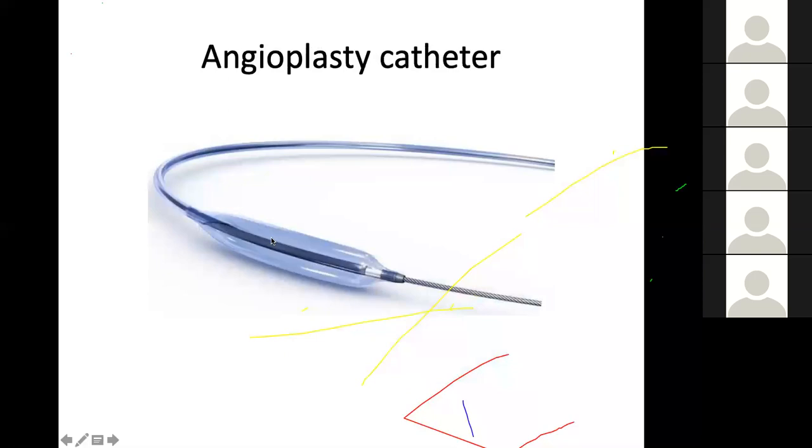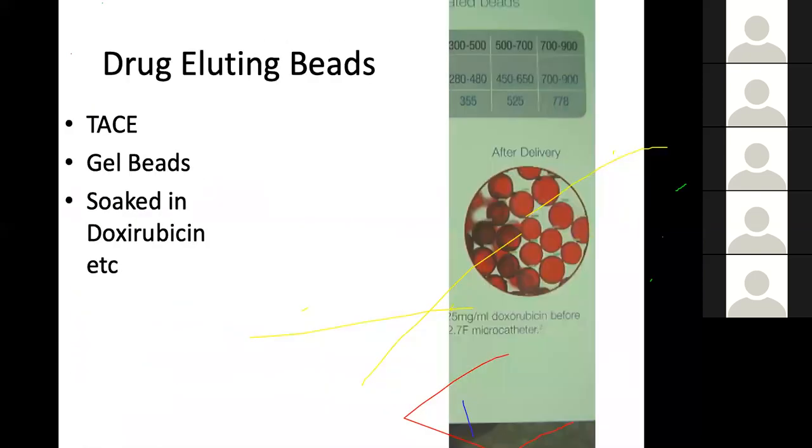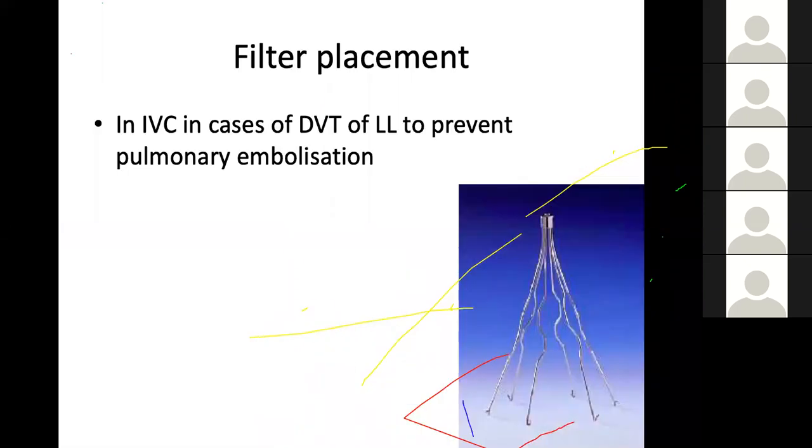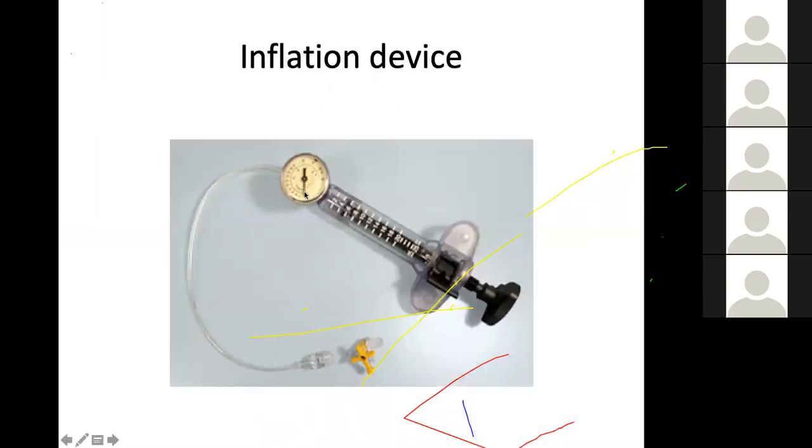So at the proximal end of this catheter, we attach the inflation device, and then we can inflate it to the safe limit that is much below the rated burst pressure of a balloon. If we inflate it inadvertently more than that, the balloon can also rupture. So the inflation device is used for controlled inflation.